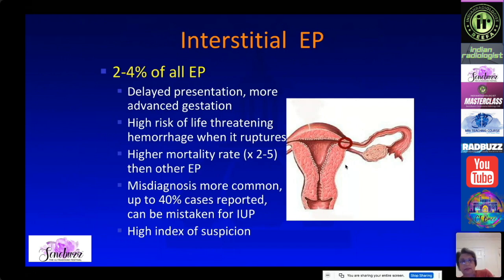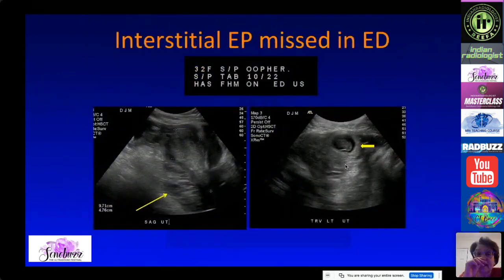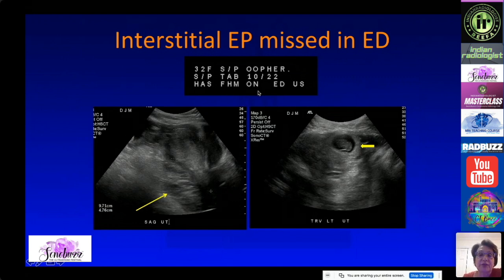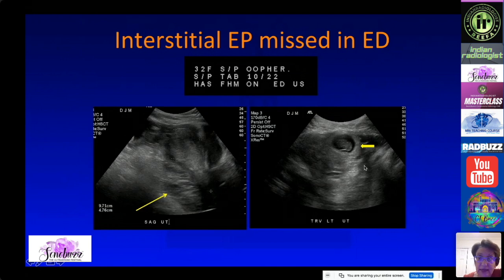They have higher morbidity and mortality compared with other ectopic pregnancies. Here is an example of an interstitial ectopic pregnancy that was missed on point-of-care ultrasound in the ED. The patient reportedly had an abortion elsewhere and had fetal heart motion on ED ultrasound, but wasn't doing well. On formal ultrasound, there is a large amount of clot in the cul-de-sac with a live fetus, but the pregnancy is very eccentric.